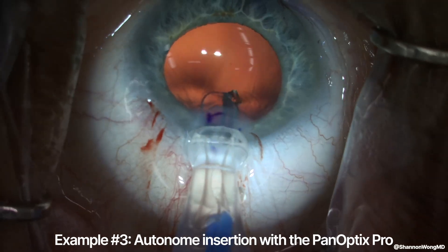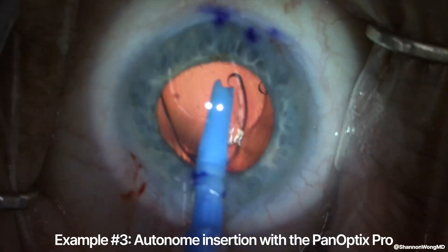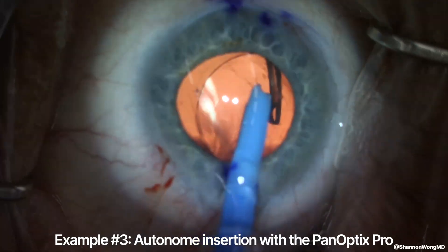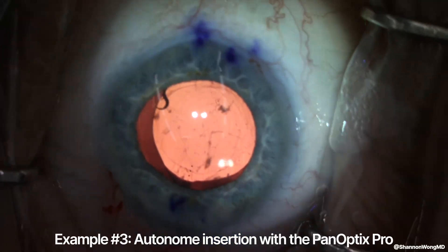Case number three, the leading haptic comes out backwards and pointing toward the capsular bag, and again we have to maneuver the leading haptic to get it to orient correctly.